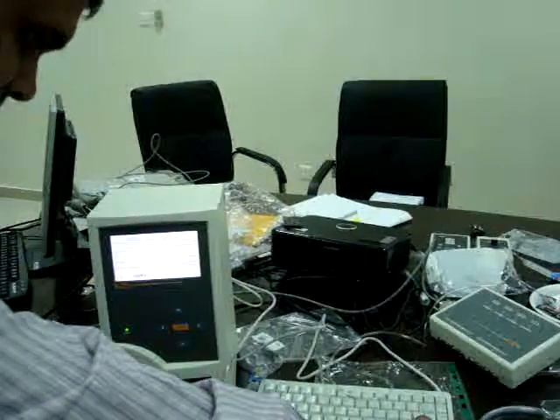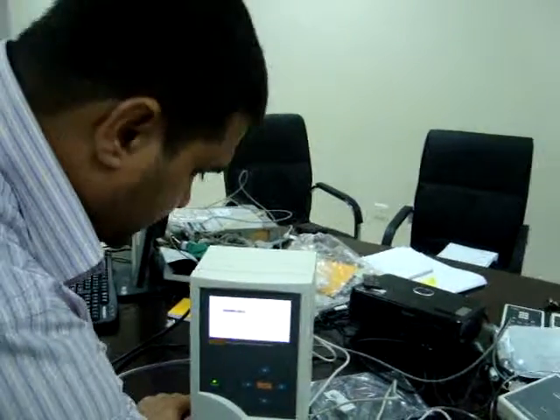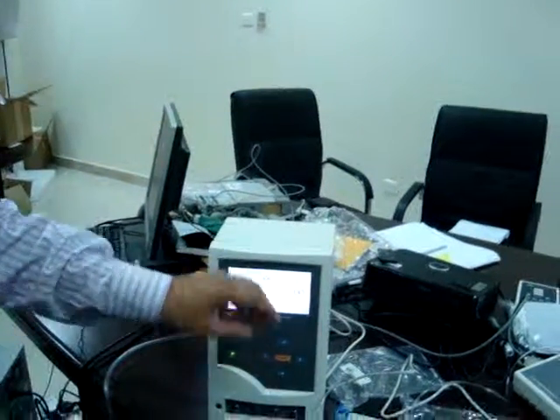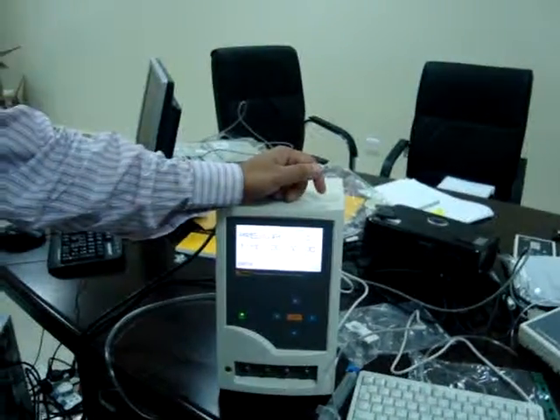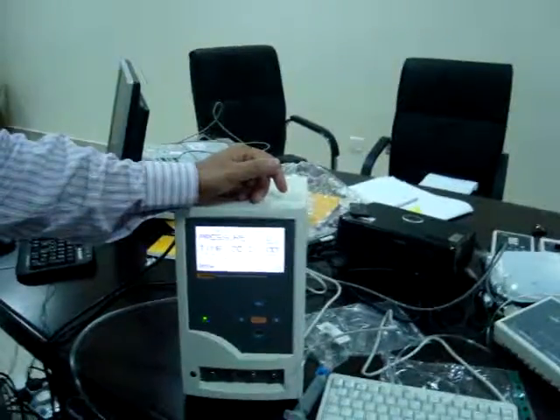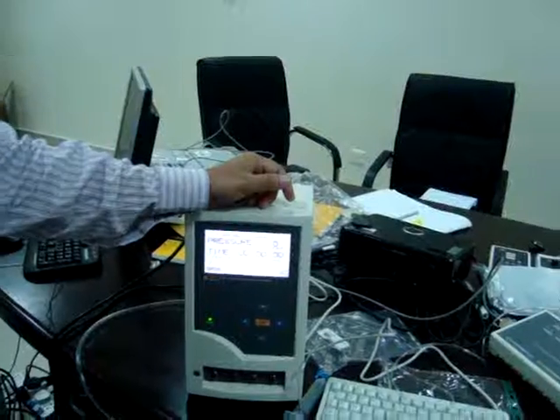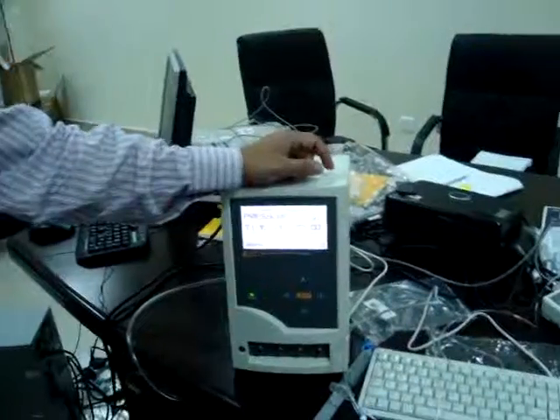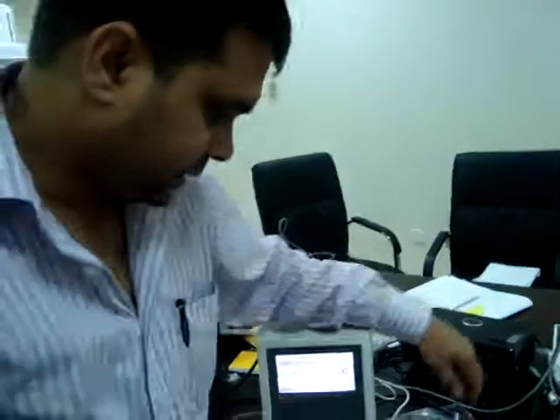Now let us go to setup. You can set up all the parameters, like occlusion. You can set at what pressure you want the occlusion alarm to go. How could I know the occlusion pressure? You have to match with the device. I have to read the catalog of this device. Then peak pressure and peak time.